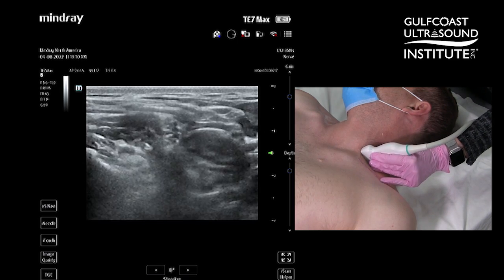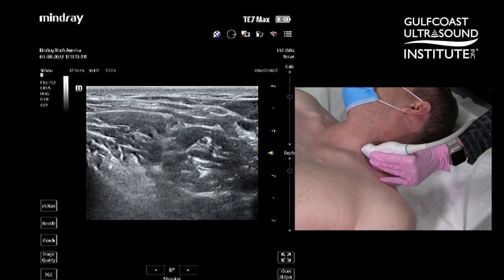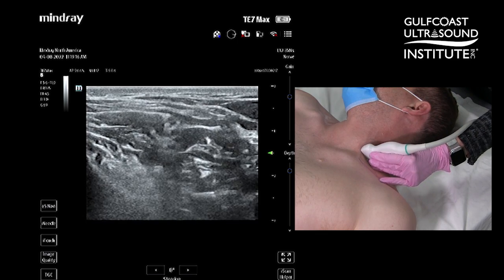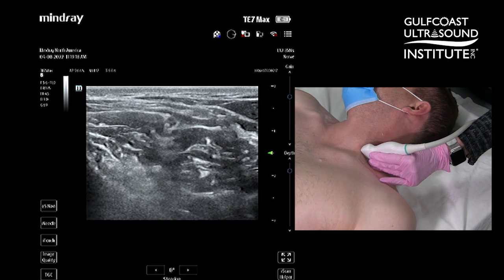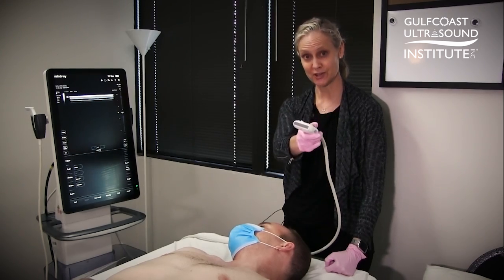And that's the nerves of the brachial plexus at the level of the scalenes, which is your target location for performing regional anesthesia for a block used for shoulder reduction. That's my hot tip of the day — now it's your turn to try.